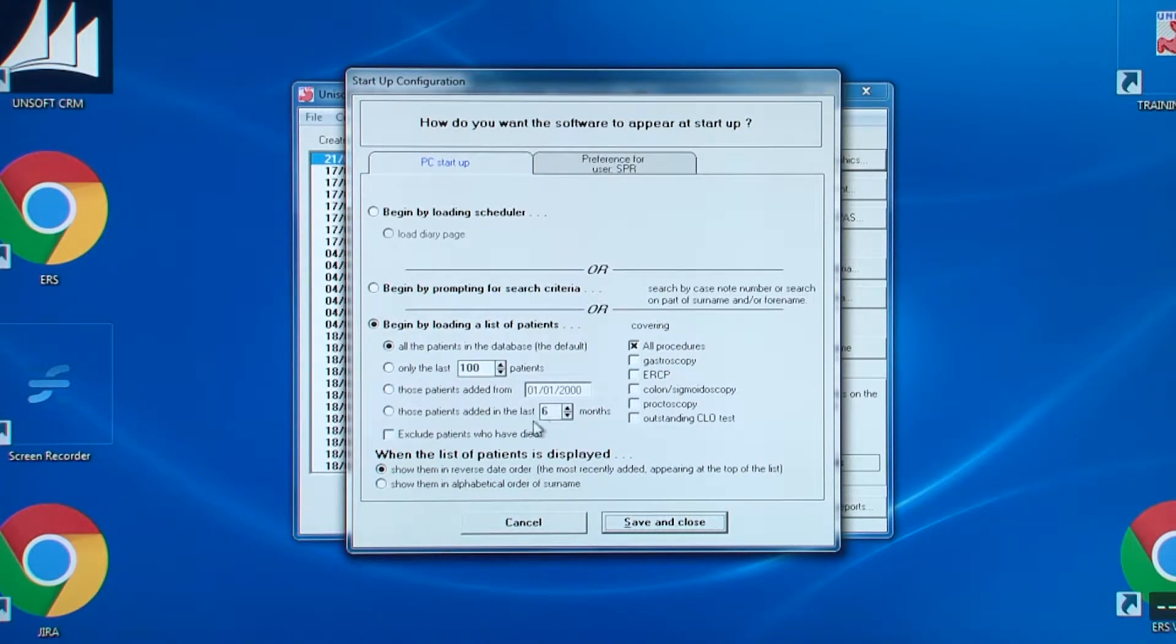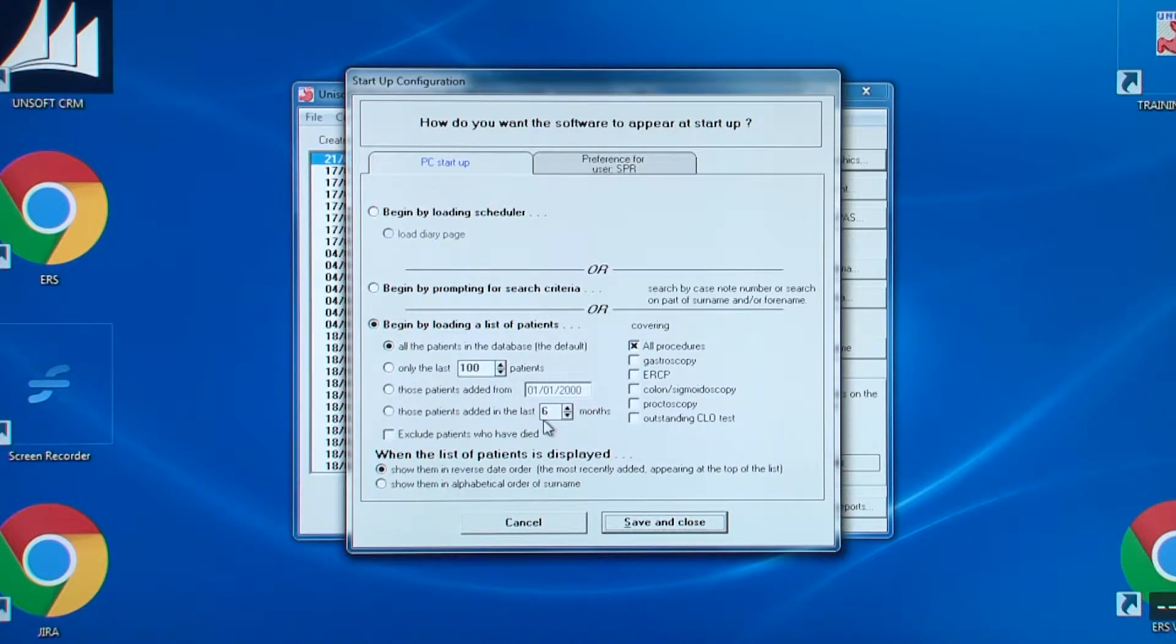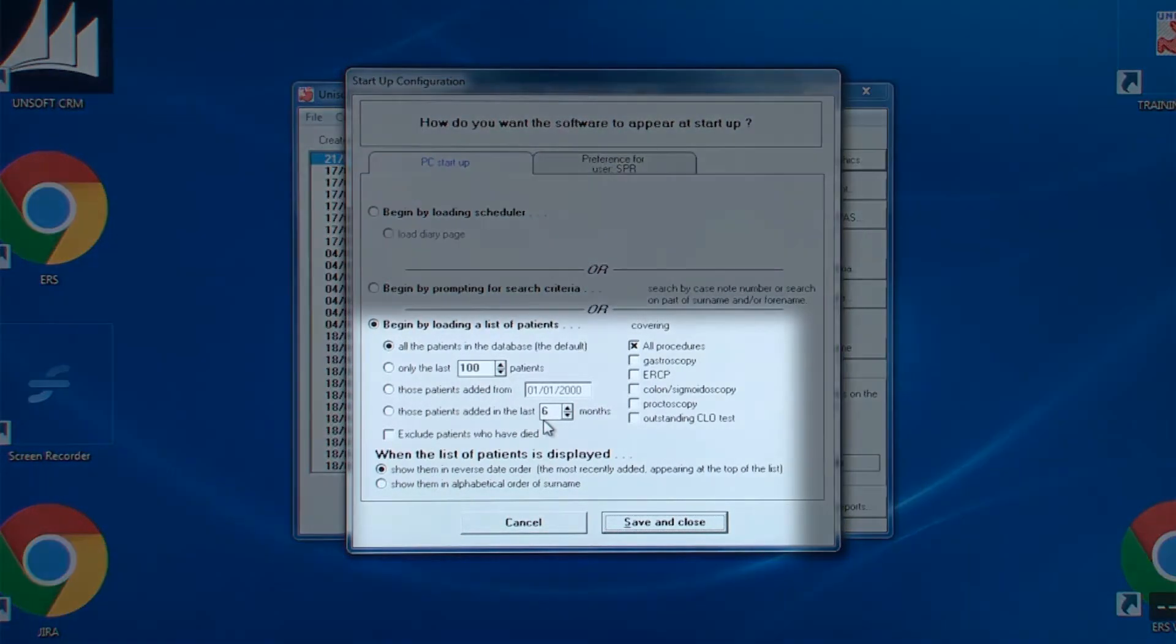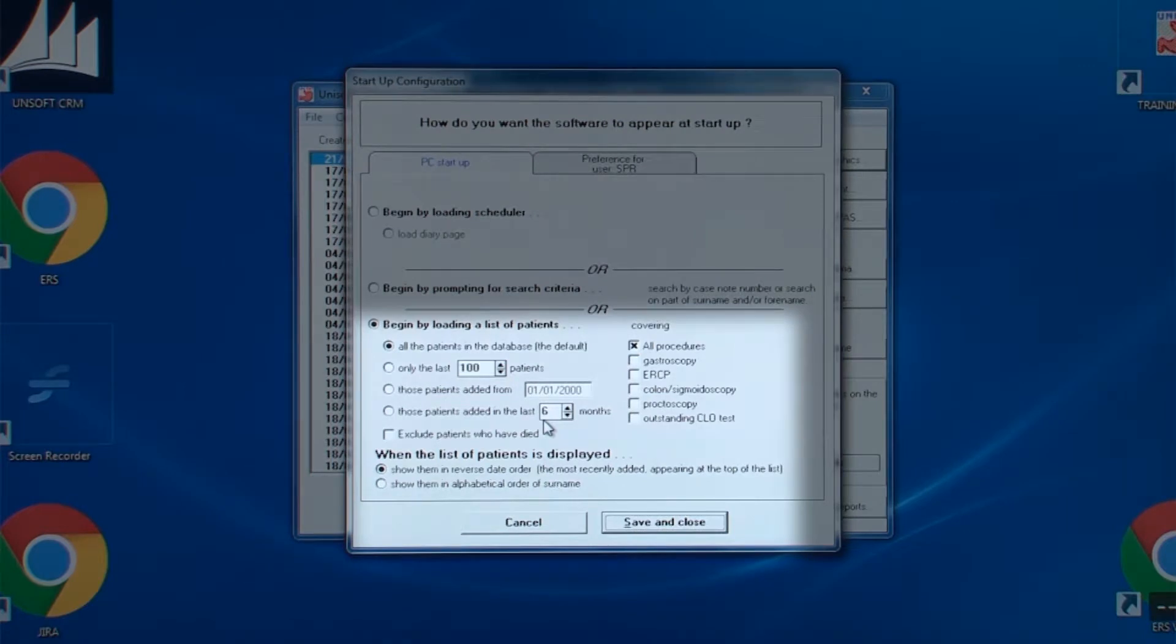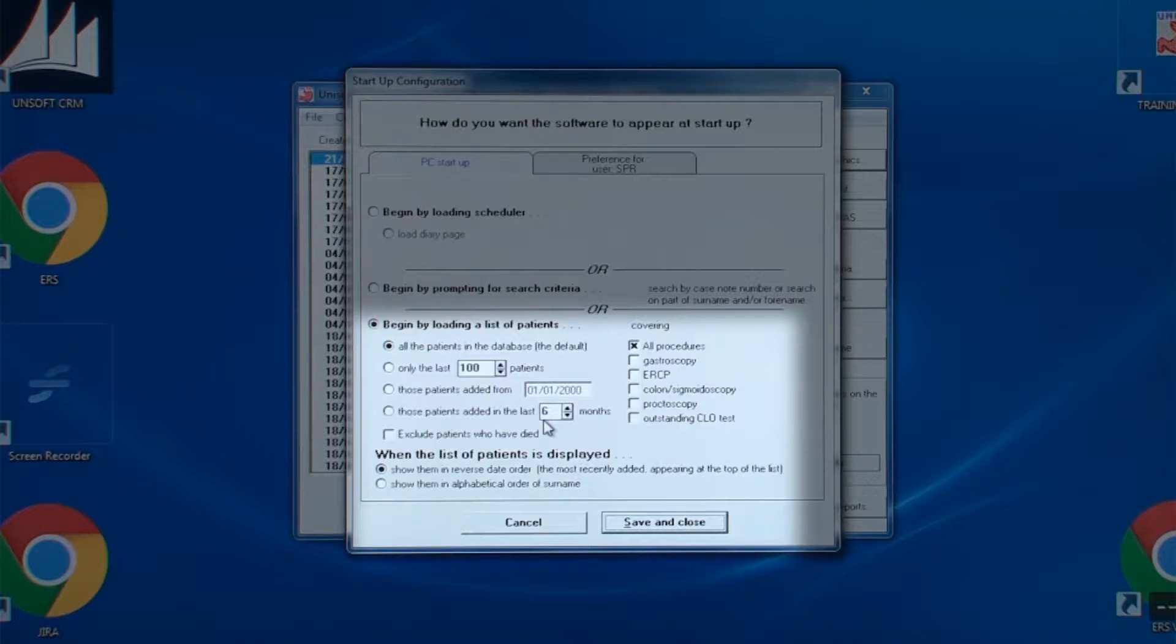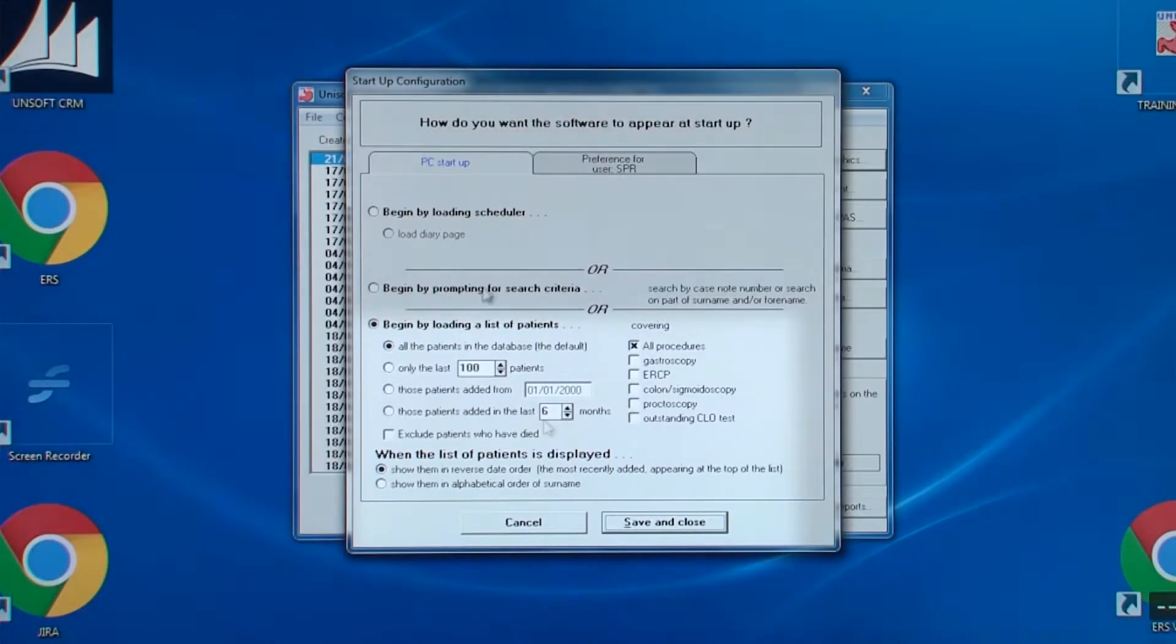There are three main options for determining how the software starts up. The default is by loading the list of patients for all procedures with the most recent downloaded at the top of the list. You can change these defaults so that they only display the last so many patients or those added since a certain date or those added in the last so many months.